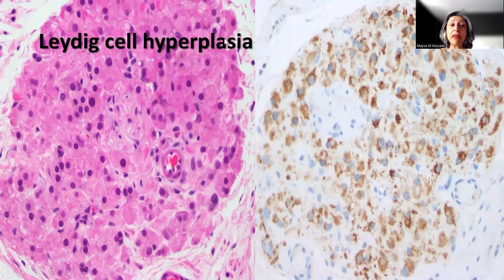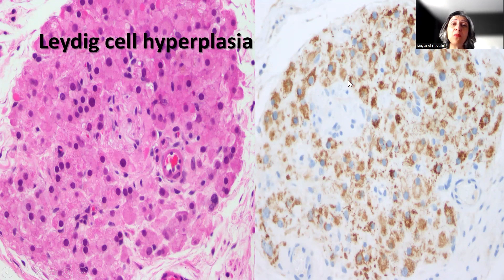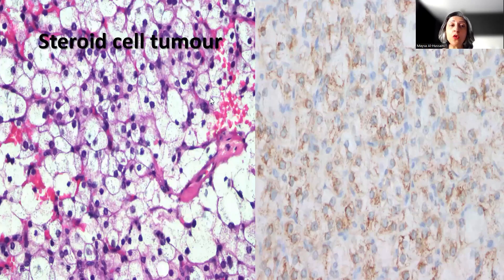Not only this, but in Leydig cell hyperplasia as well as Leydig cell tumors in the ovary — this has not yet been tested within the testicular parenchyma or tumors, this is only ovarian. Frequently in the hilum of the ovary, we encounter these aggregates of Leydig cells, and these beautifully show the cytoplasmic granular staining, which is very brisk and very characteristic, whether this is hyperplasia or a tumor.